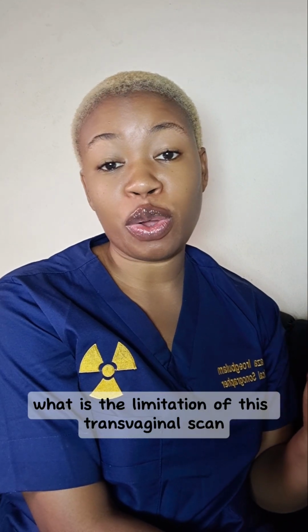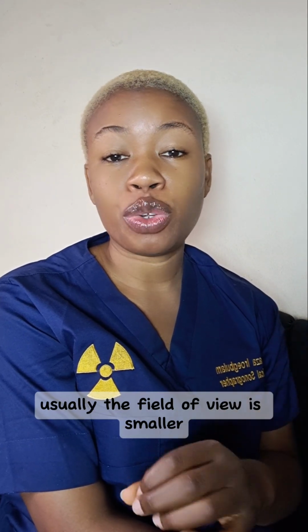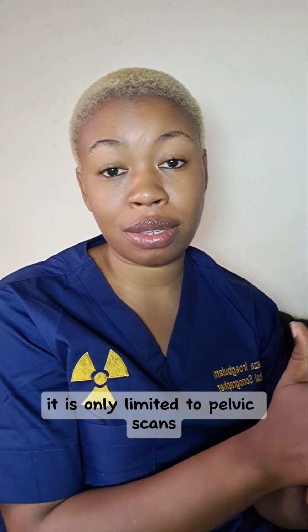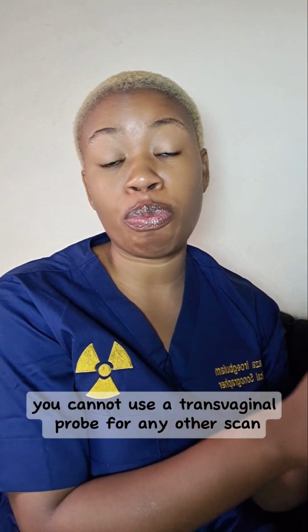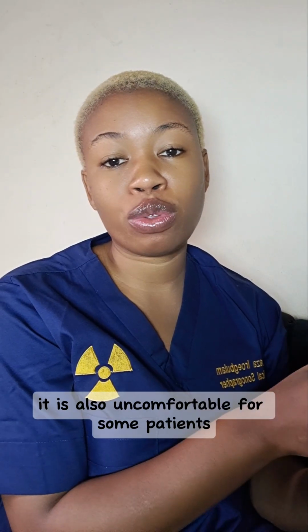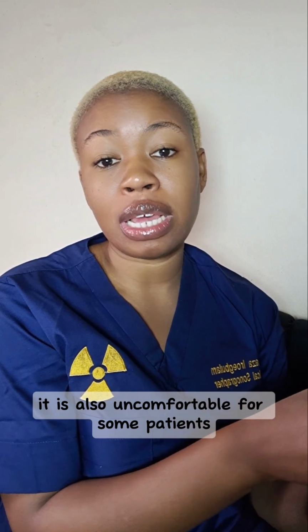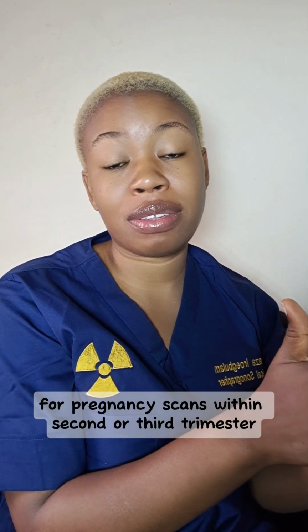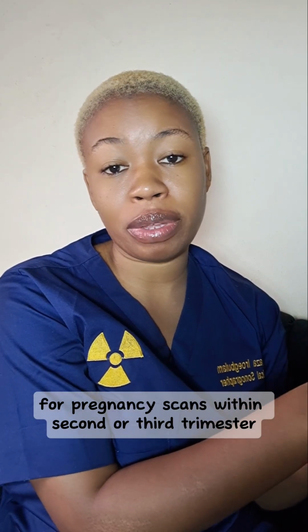What is the limitation of this transvaginal scan? Usually the field of view is smaller. It is only limited to pelvic scans. That is, you cannot use a transvaginal probe for any scan other than a pelvic scan. It is also uncomfortable for some patients, and it is not ideal for pregnancy scans in the second or third trimester.